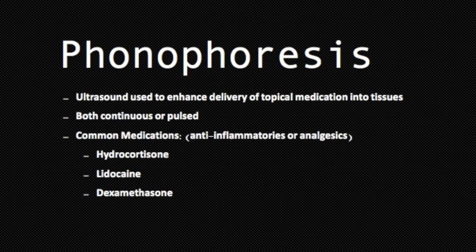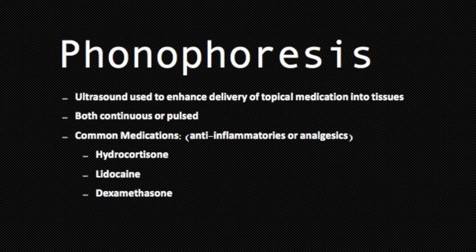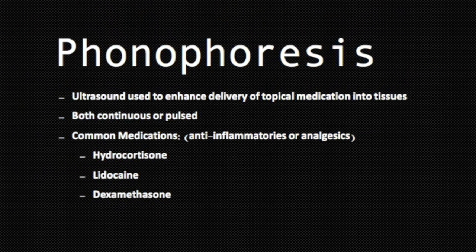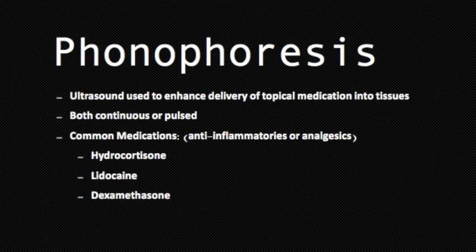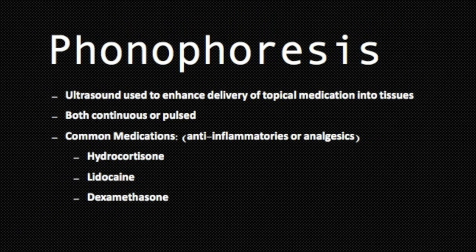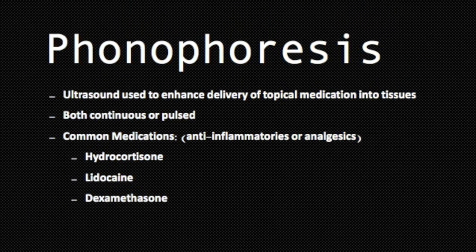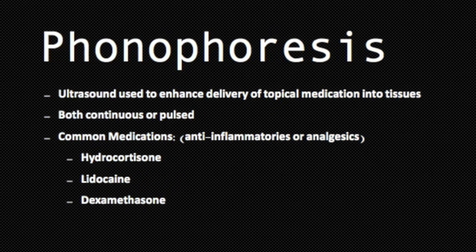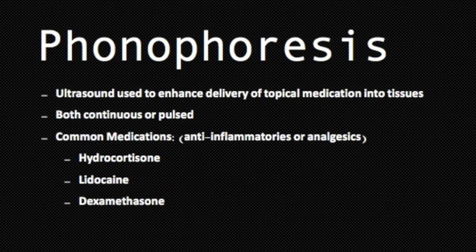Phonophoresis is a use of therapeutic ultrasound to enhance the delivery of a topical medication into the tissues. It can be done either continuous or pulsed. A continuous wave ultrasound is when a constant ultrasound wave is provided throughout treatment, providing energy the entire time. Pulsed wave ultrasound is when there is an interruption in energy being produced during treatment and no energy is provided.